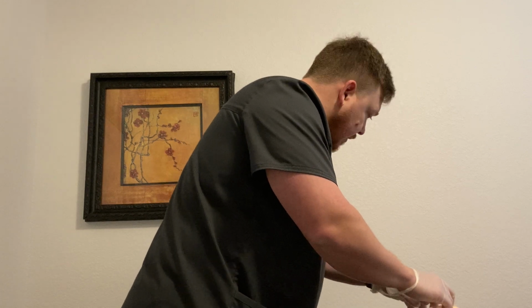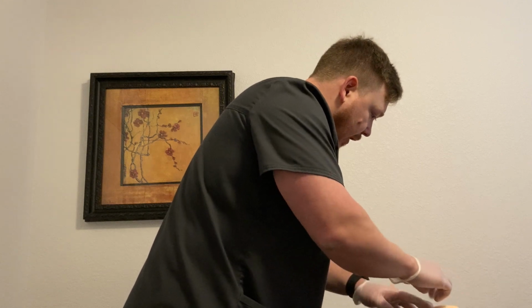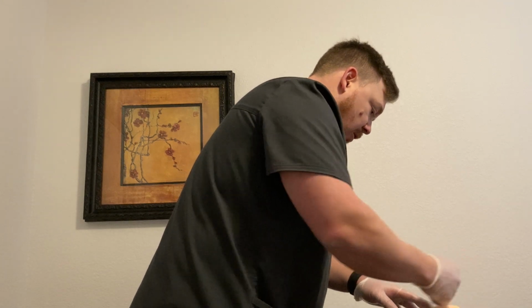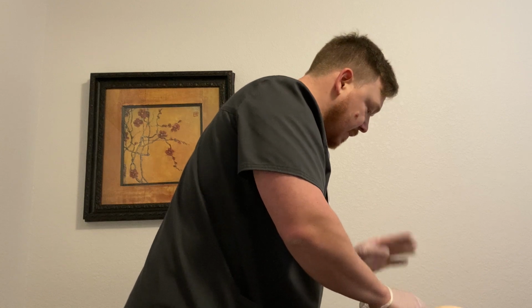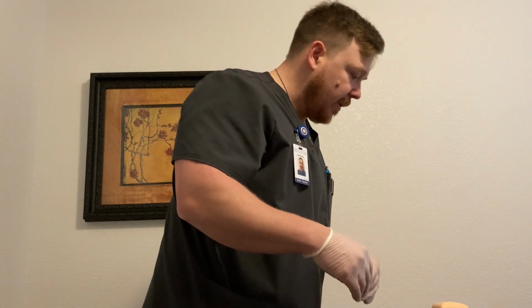It doesn't feel tender. Do you have any pain in your abdomen? No? Okay. I'm going to make sure I avoid at least 2 inches around your belly button there. So we're going to go over here, probably on the side closest to me. We'll inject pretty laterally over here. Okay, Mr. Jones? Or Mr. Smith? Alrighty. That looks good. I'm going to go ahead and prepare your medication, okay?